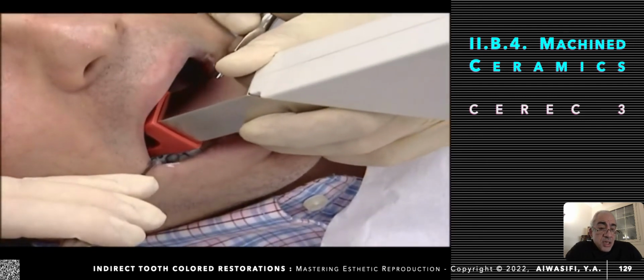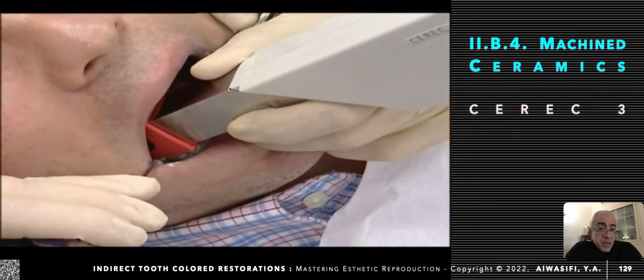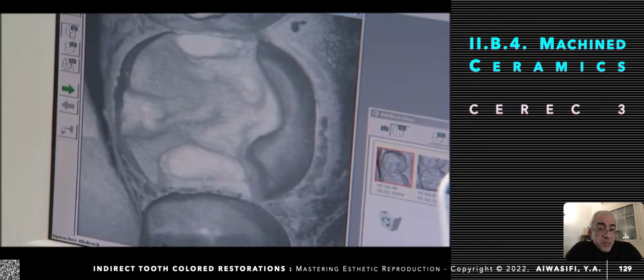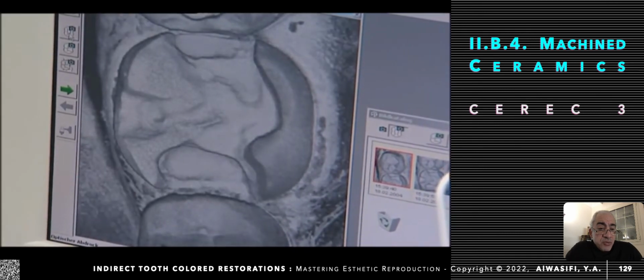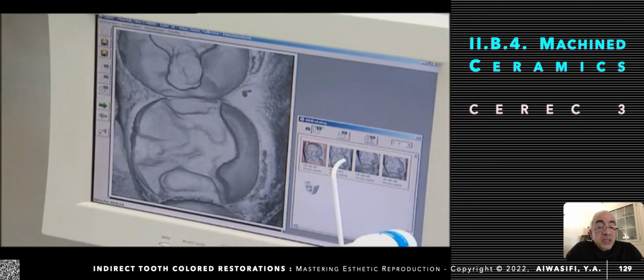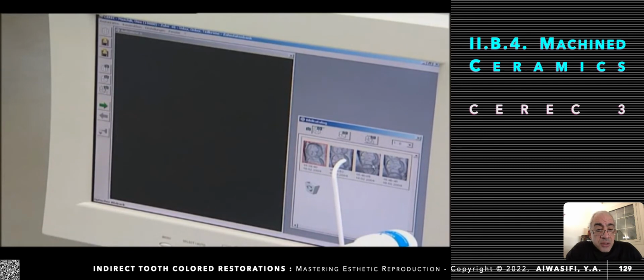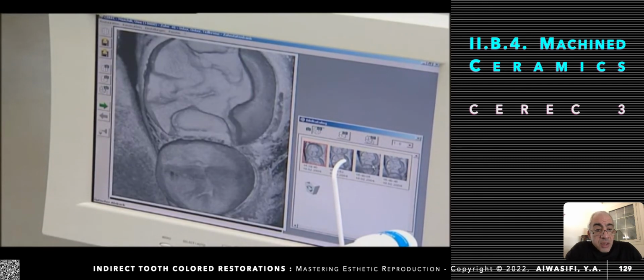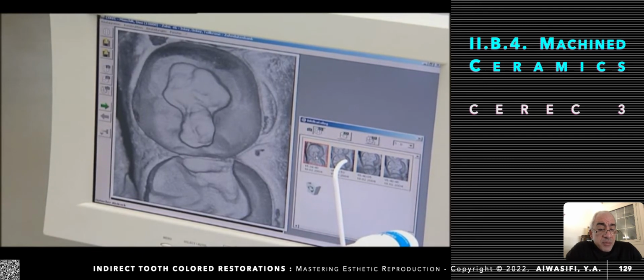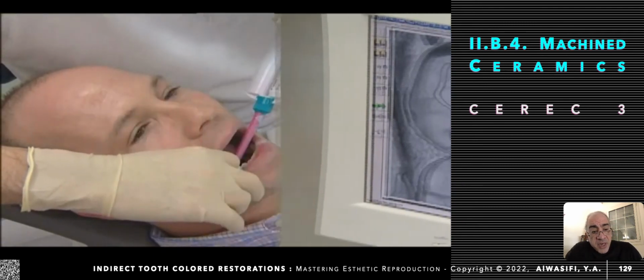Then this is the camera. The camera is controlled by a foot pedal. Okay. Camera should be parallel to the long axis of the tooth to get a proper top view. Now you could note that the undercuts are not registered. Okay. He's taking too many pictures to select the best one, and this is for the neighboring next tooth.